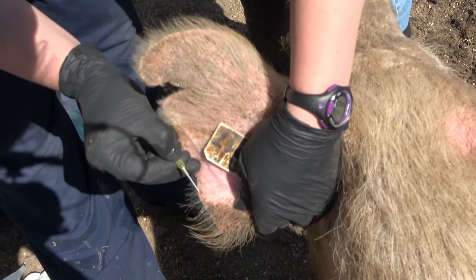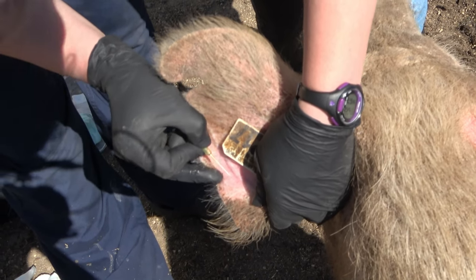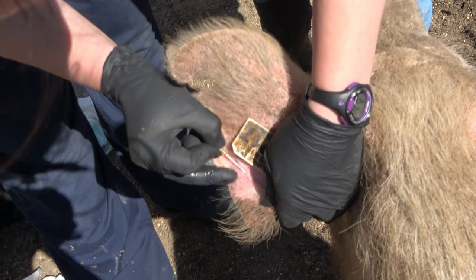All right. It's a very superficial vein, so we're gonna take a nice shallow angle.